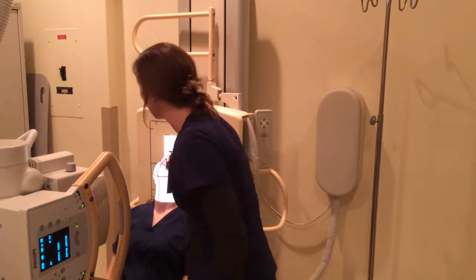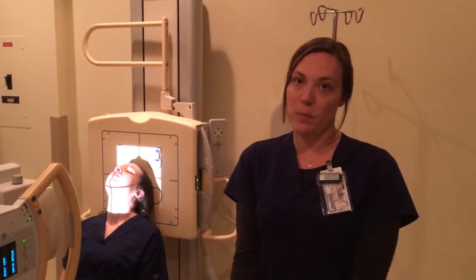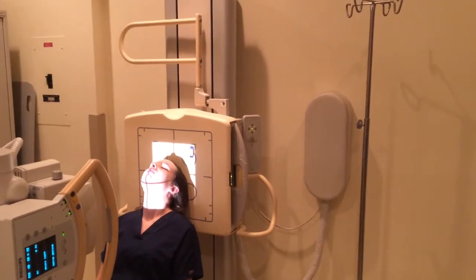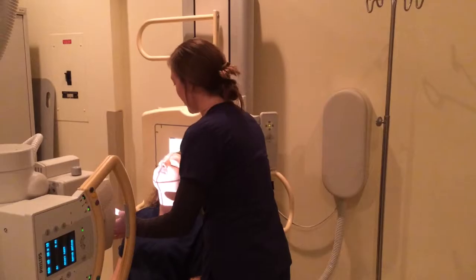Okay, the technique I'm using is 85 kVp at 28 to 32 mAs. Okay, don't breathe, don't move, x-ray. Okay, that's good.